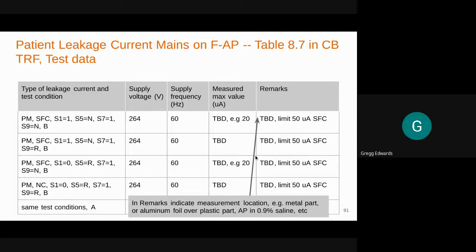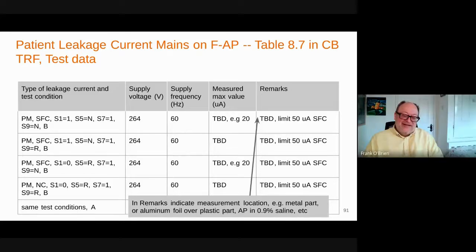The Hioki or that type of instrumentation is handy in the right hands, but I think it could be dangerous as well. Well, they're great, aren't they? You just hit a few switches, and everything's done. But if you think about the prep, you're still hooking up all those cases, and then the switches go through their thing, or it might be multiplexed. So for production, it's important to sort that out in an automated way. I would certainly second that. But in verification activities, maybe it's important to be flexible and look at things and learn as you go, seeing what's really going on.